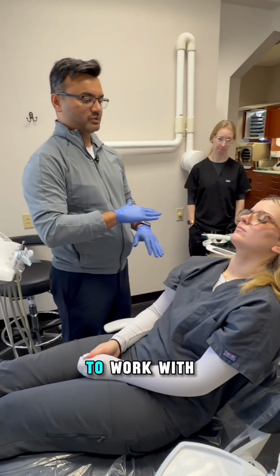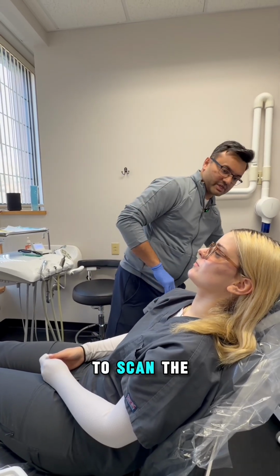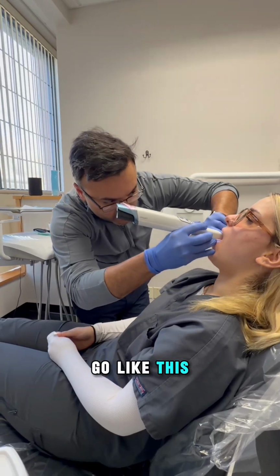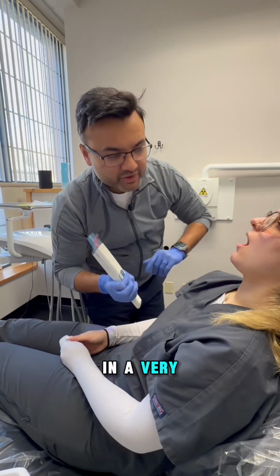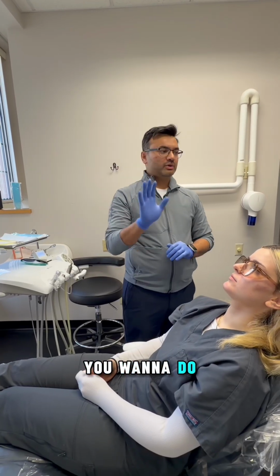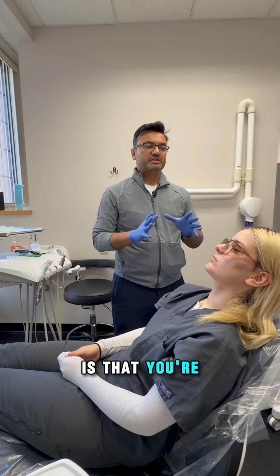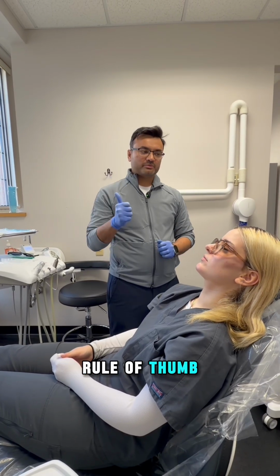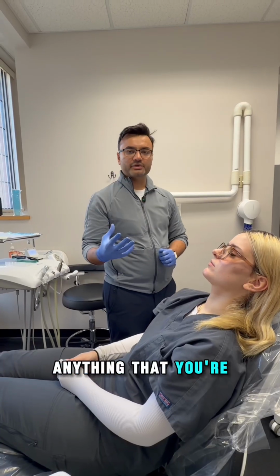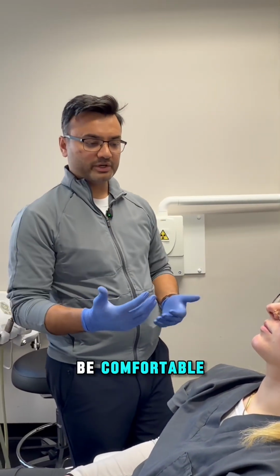Anything that has to do with the patient's mandible, the most common problem is that we start to scan with the patient open wide, and we go like this and get the scanning started in a very uncomfortable position. Remember the rule of thumb. You want to do any work on the mandible, we'll talk about sitting down position, but for now, you're scanning, you're standing up. Rule of thumb when you're scanning or doing any work, follow-ups, post-ops, anything on the mandible, you want to have good ergonomics, you want to be comfortable.